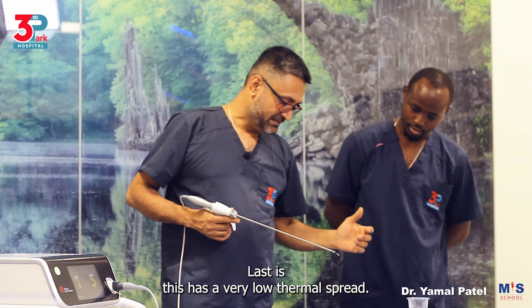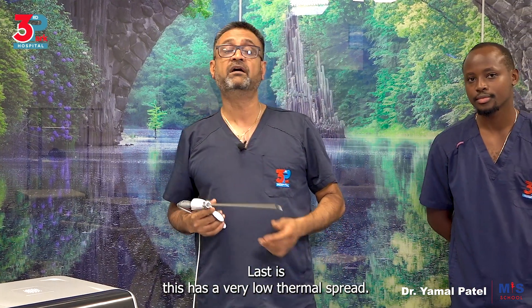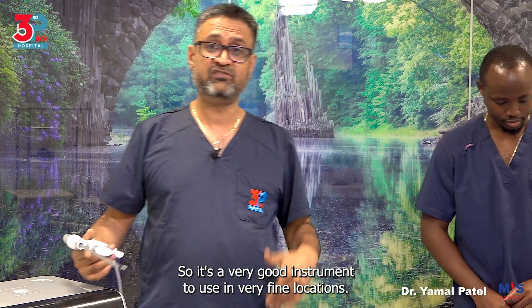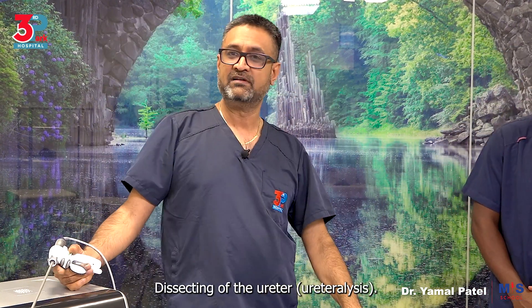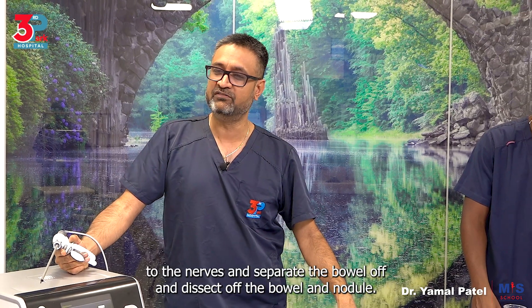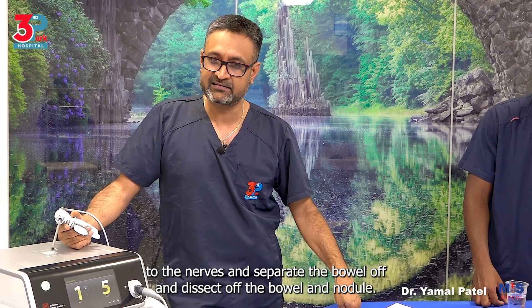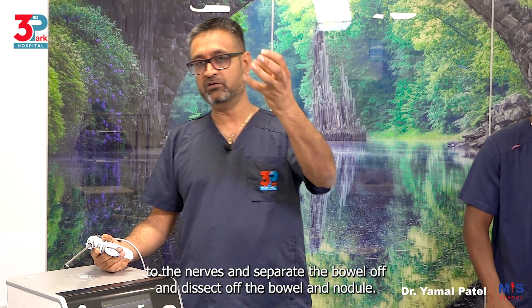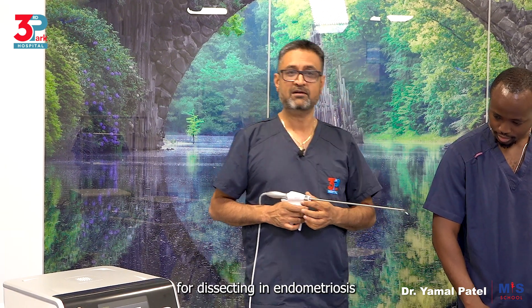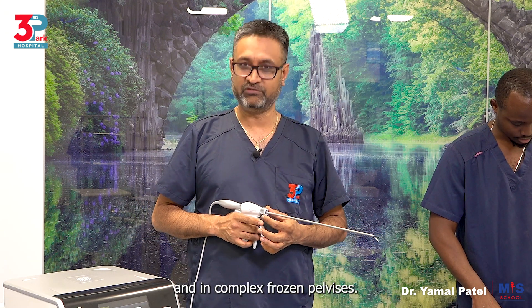This has a very low thermal spread, so it's a very good instrument to use in very fine locations — dissecting of the ureter, ureterolysis. It's very good in endometriosis dissection where you want to go to the pararectal space, close to the nerves, and separate the bowel off and dissect a bowel nodule. Basically speaking, it's a very good tool for dissecting in endometriosis and in complex frozen pelvises.